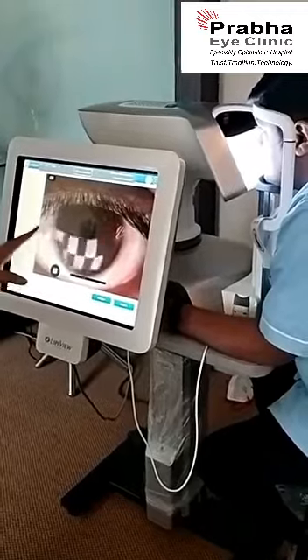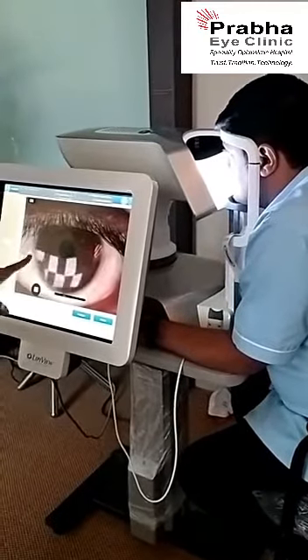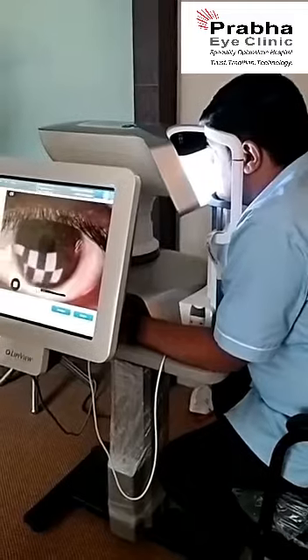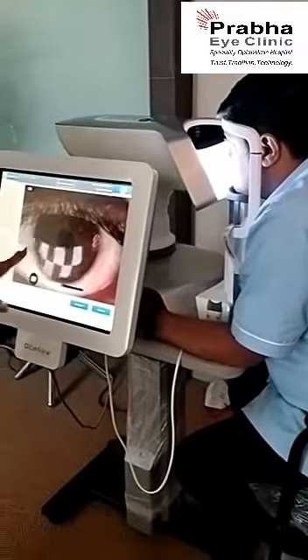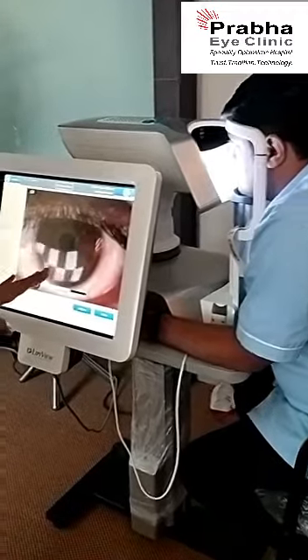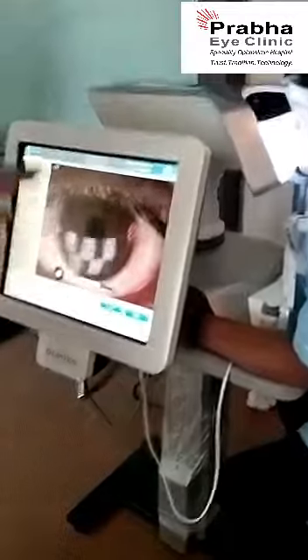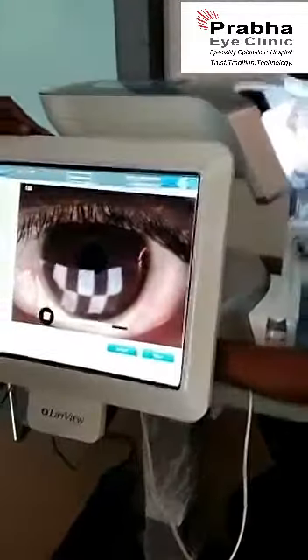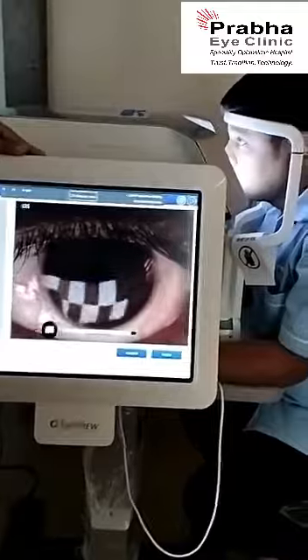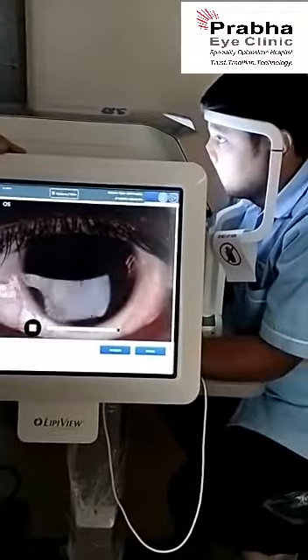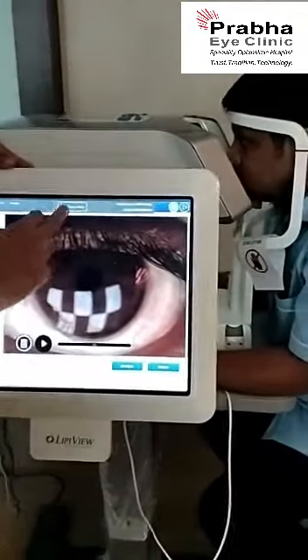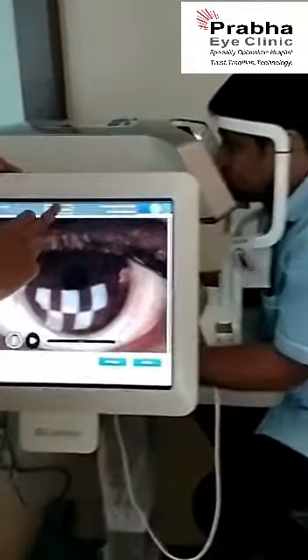As we can see, the equipment is capturing the different layers of the tear film. There are different shades of colors that occur, and these give us an idea about the oil glands and the oil film of the tear layer. Once the capture is complete, we can also analyze the results.